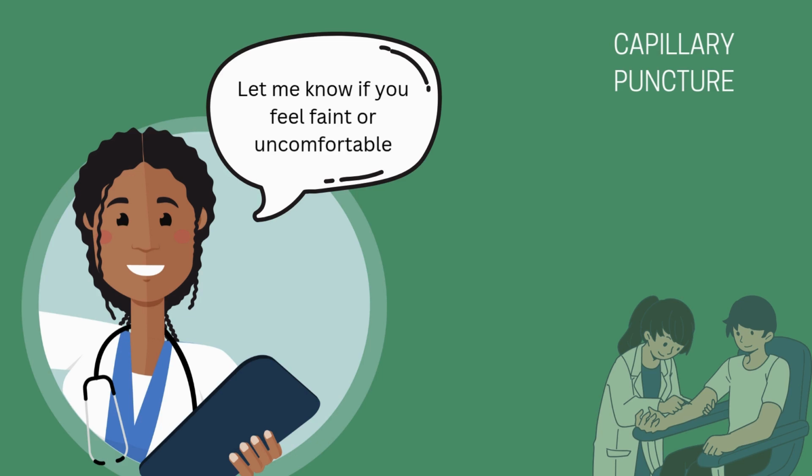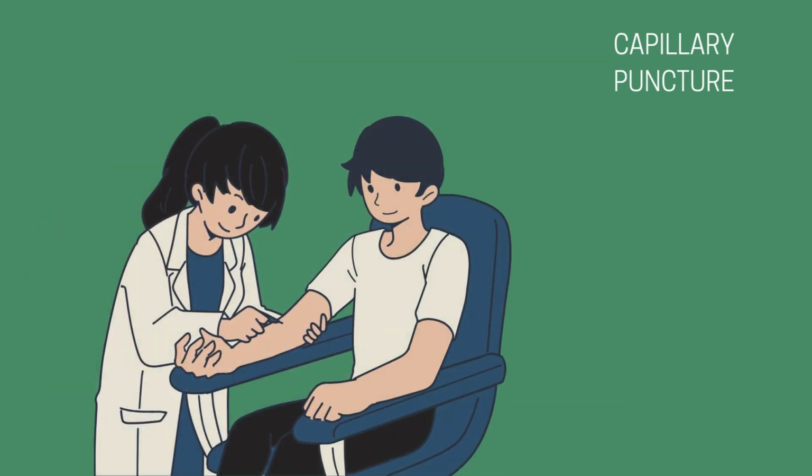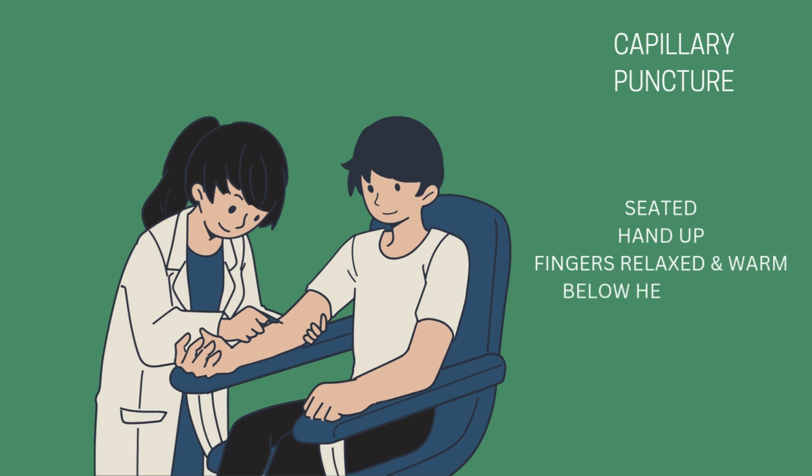What other ways can you describe the procedure to the patient? For capillary puncture, patient positioning depends on the site being used. If the finger is used, the patient should be seated comfortably with their hands supported, palm up, and fingers relaxed and warm. The arm should be at or below heart level to encourage blood flow.